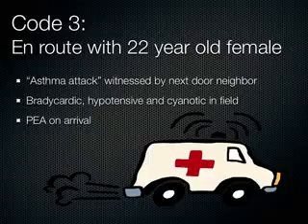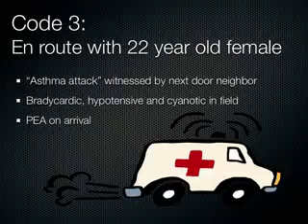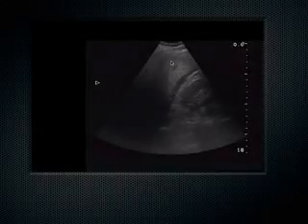Well, when she got into our emergency department, she was actually in pulseless electrical activity, and we weren't really sure what was going on. We heard that she was having an asthma attack, but we were bagging her after intubating her, and her lungs were clear, and she was really easy to bag, so we figured maybe that's not it. And so we thought, she was found outside, maybe she was hit by a car, so we do a FAST exam. Here's the kidney, this is the liver, this is an old scan, so it's kind of hard to read, but this is the fluid sitting here in Morison's pouch.